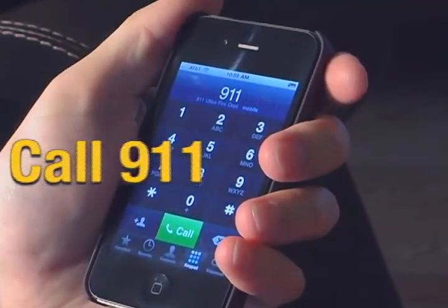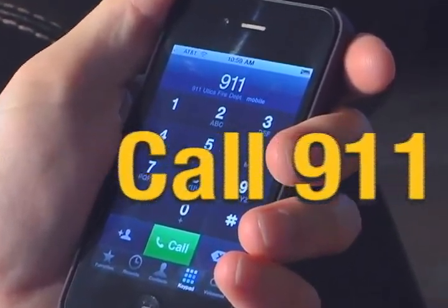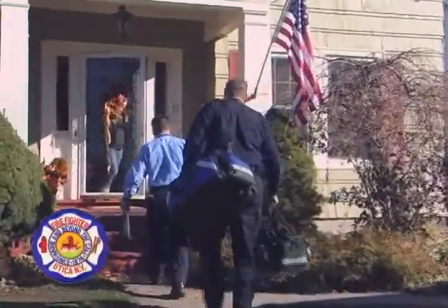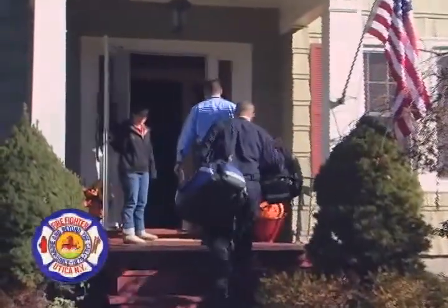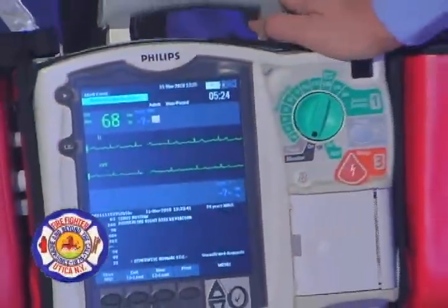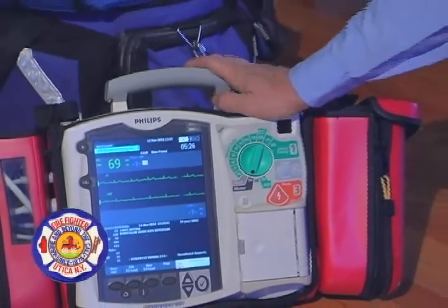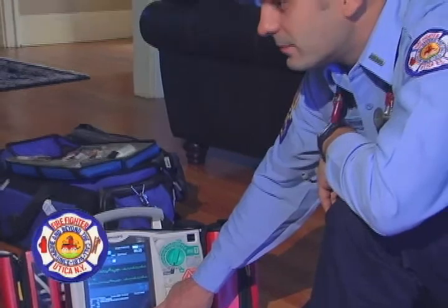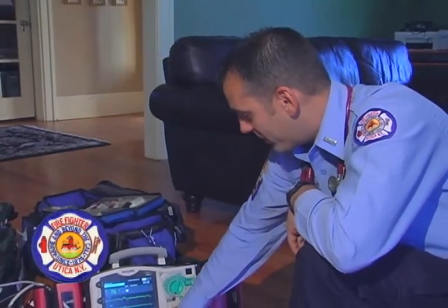Basically, the ambulance rolls up to the scene. You've called because you have chest pain, shortness of breath, difficulty breathing, sweatiness, some nausea, vomiting. So we think that there's a heart attack actually occurring in the patient. So the ambulance rolls up, the paramedics come in, they bring in a heart monitor, which basically takes a picture of the patient's heart. This is captured on the heart monitor, and it used to be this picture was taken to the hospital along with the patient.